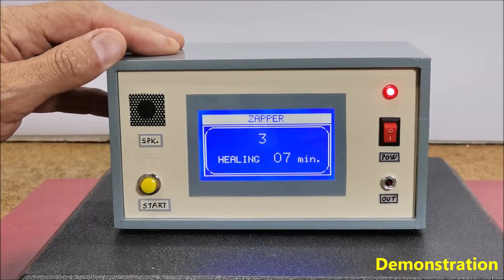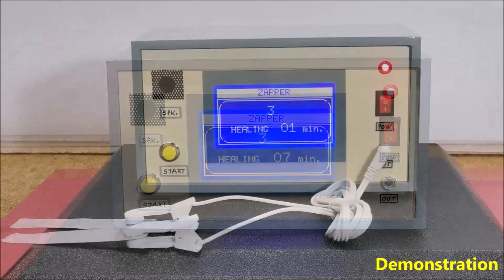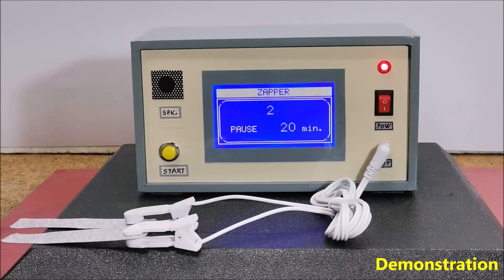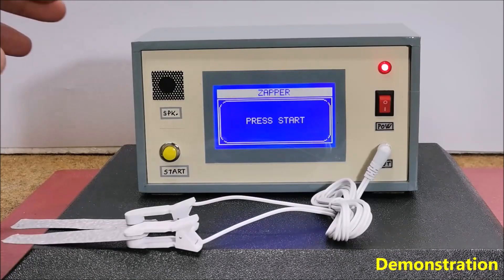This timing data is embedded in the code, whereby there are 3 phases of the therapy. After the therapy is finished, we hear 3 beeps and the display shows a prompt message to press a button to start a new therapy.